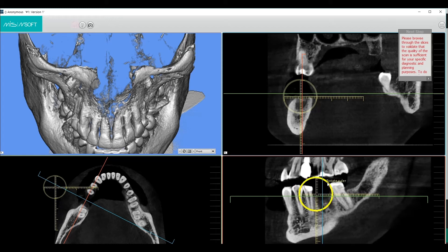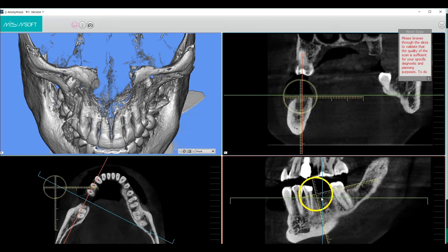When a surfing plane is activated, press SHIFT in order to rotate the axis. The cursor wheel will allow you to zoom in and out.